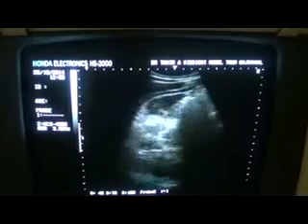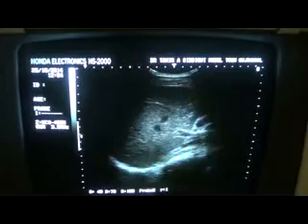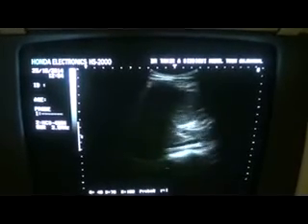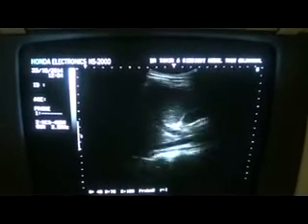This is the kidney — it appears normal. All measurements are within normal limits.